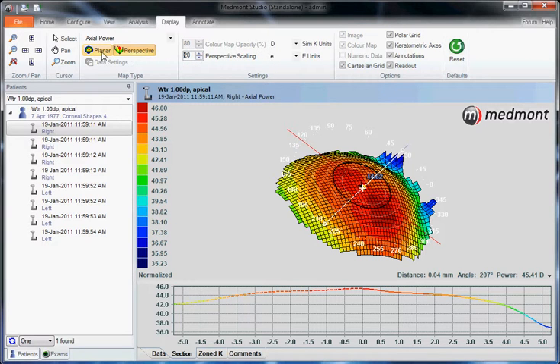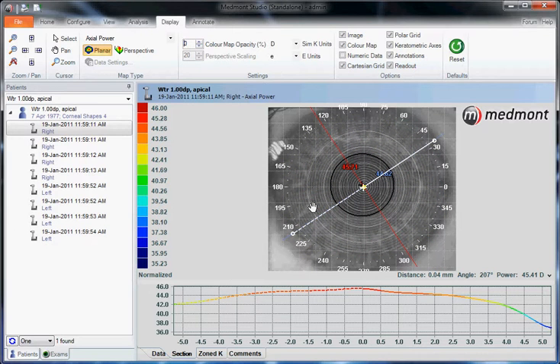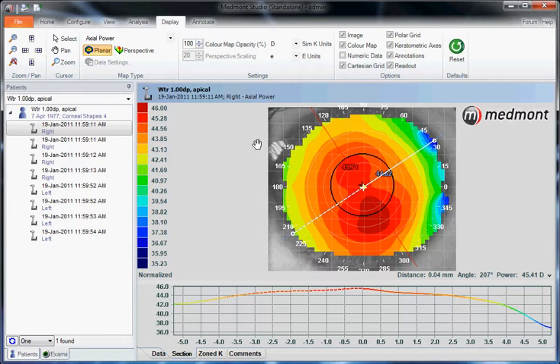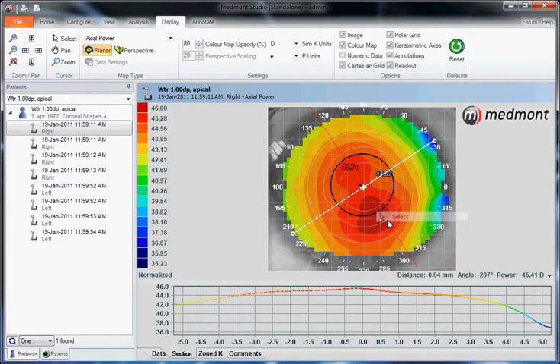Let's go back to planar view. We can change the color map opacity to bring out the rings behind the color map, or conversely increase the color map opacity to 100%, making it impossible to see the rings underneath. You may find that 70 or 80% gives you the right balance of bright colors but the ability to just faintly see the rings underneath, to determine if any particular area is giving you false or suspect information.